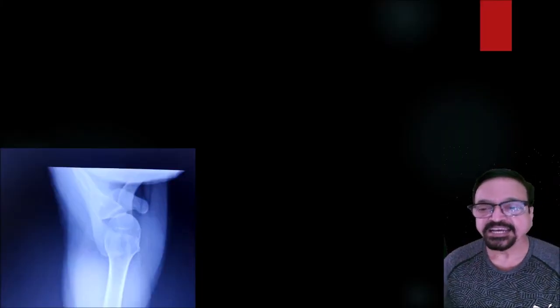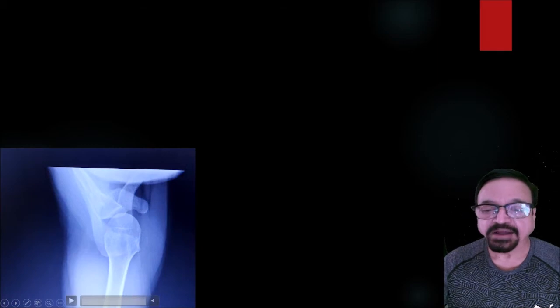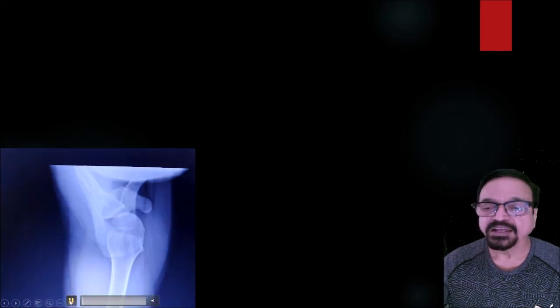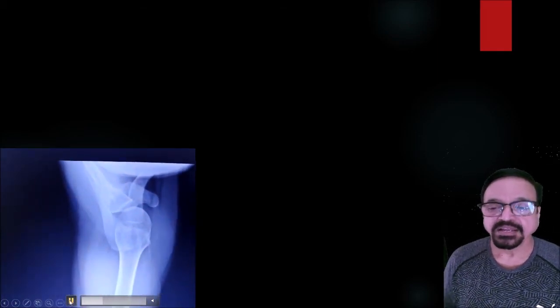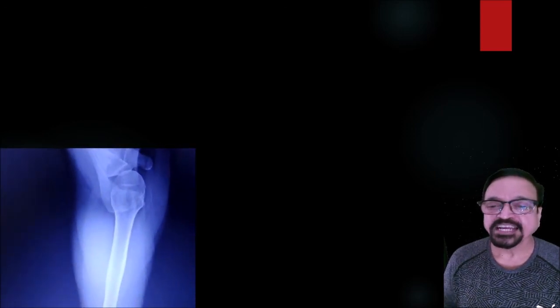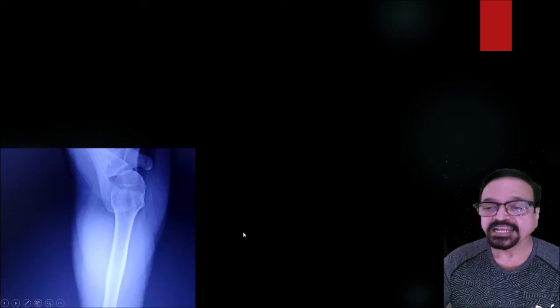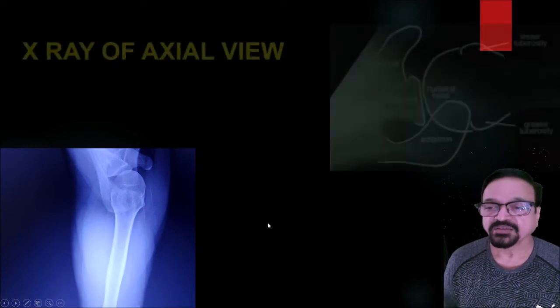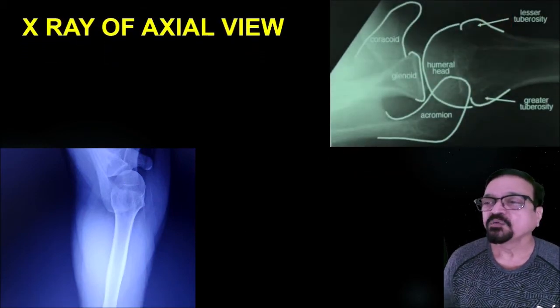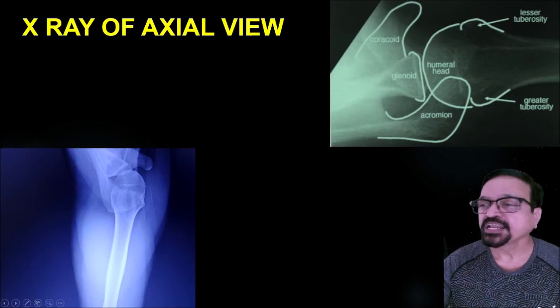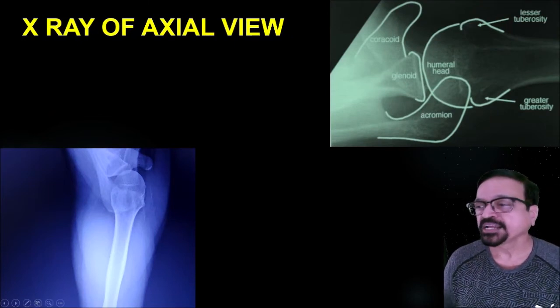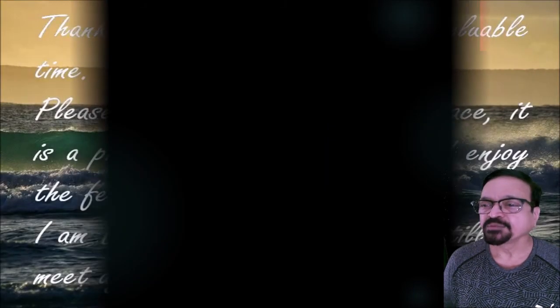Now you are seeing it here. The advantage of DR — you can immediately see the result. We are showing this because it is the same patient whose x-rays were just taken. Here you are seeing a perfect axial in which the coracoid process, acromion process, and head are all well seen. What you see here is the coracoid, glenoid, acromion, and humerus. The tuberosities — both lesser and greater — are also well seen.